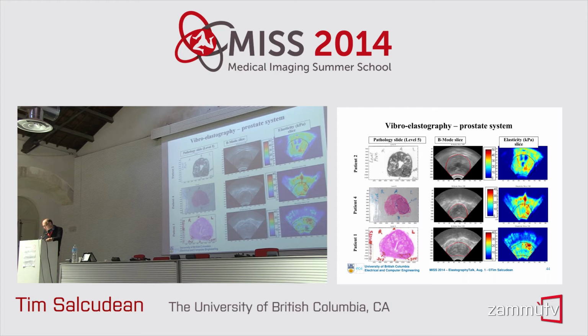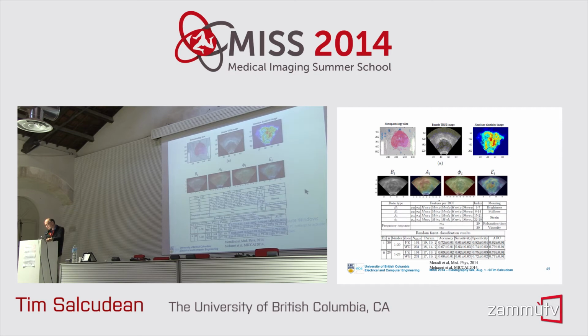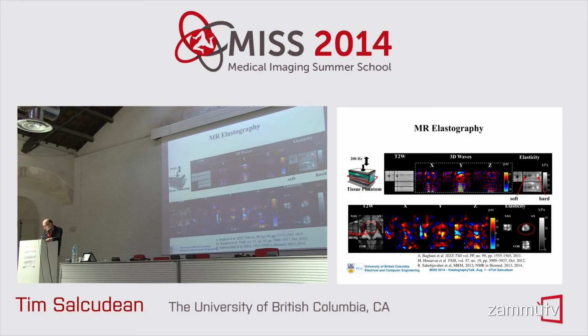And we have here one region which is much stiffer that does not correspond to cancer. Okay, so this is still something to be studied. But if we use multiple parametrics, we get AUCs that are quite respectable, not quite as good as MRI, but our studies are still fairly new.